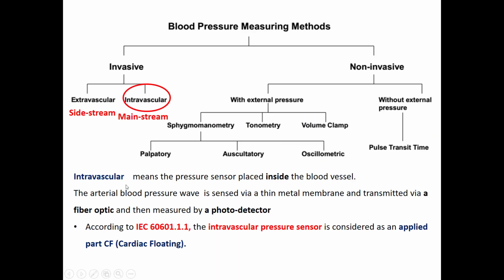So intravascular means the sensor is inside the blood vessel, and the signal will be measured directly.